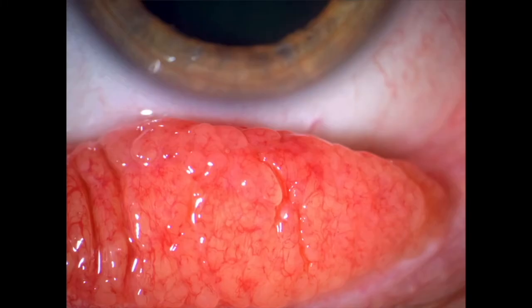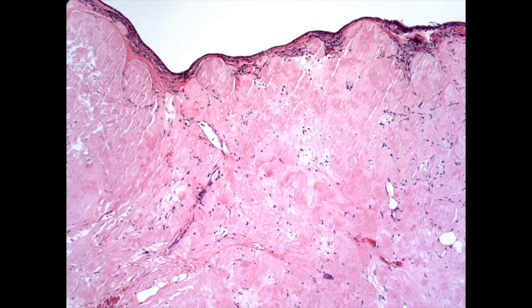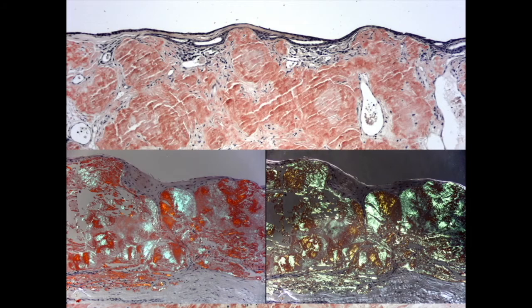Another degenerative condition is conjunctival amyloidosis. This can be quite variable in appearance. Can sometimes resemble lymphoma or sarcoidosis. Conjunctival amyloidosis typically is composed of light chains, but it usually is unassociated with systemic amyloidosis. Here's histopathology of a case showing the amorphous eosinophilic deposits in the substantia propria. These, of course, do stain positively with the Congo red stain and exhibit apple-green birefringence and dichroism with polarization microscopy.